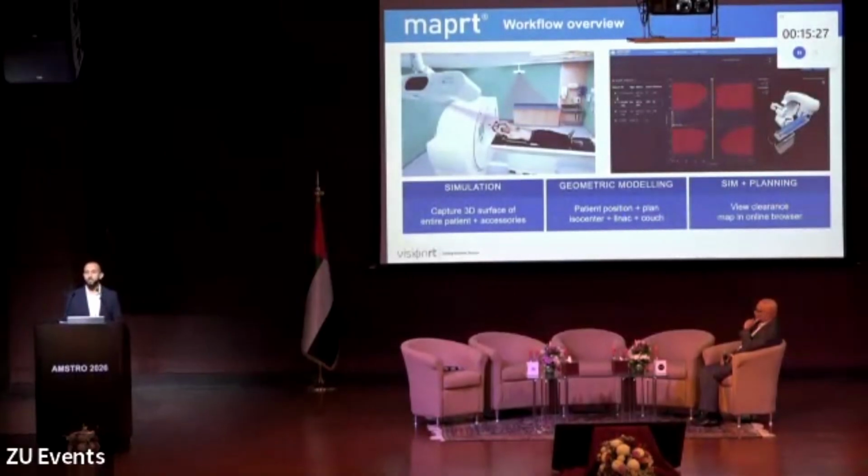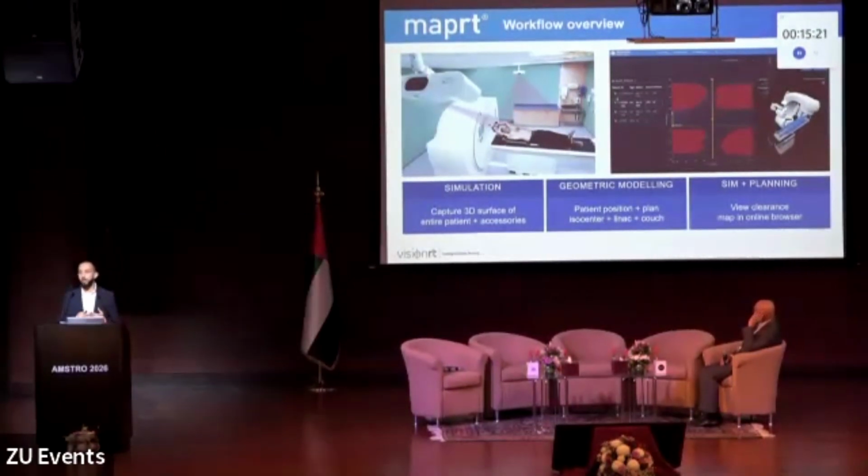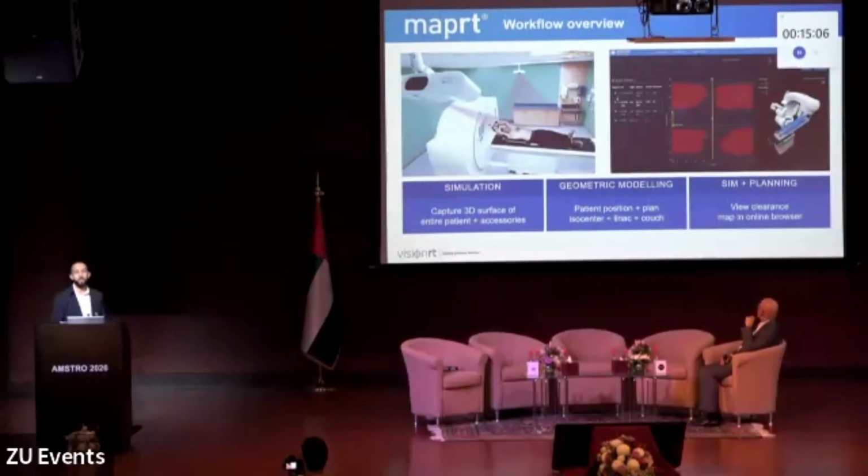It will give you the surface of the patient virtually, and we can simulate this surface to your machine. If you have multiple machines, of course, we can choose the specific machine where you are going to do the treatment for this patient, but we can also choose a different plan if there is any sort of collision in those plans.